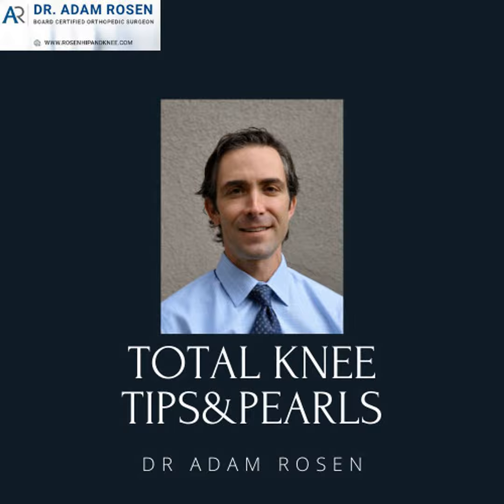So again, the approach: excise the old scar if the soft tissue envelope will allow, expose your extensor mechanism so you can close it well at the end of the case, make your arthrotomy, make your lateral kind of soft tissue release of the extensor mechanism, and then your medial release deep as you need to based on the knee. And then you're going to do your full synovectomy and then expose your extensor mechanism, flexing the knee up, deciding, do you need to protect the tibial tubercle or do something for the quad to protect it from damaging something.